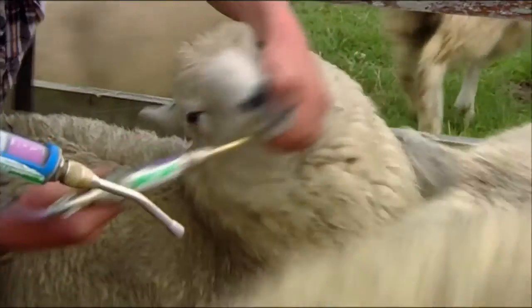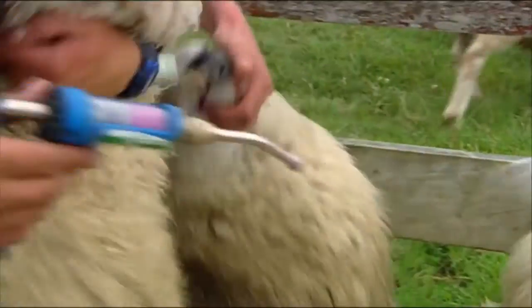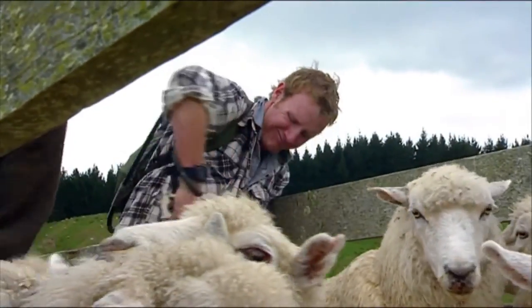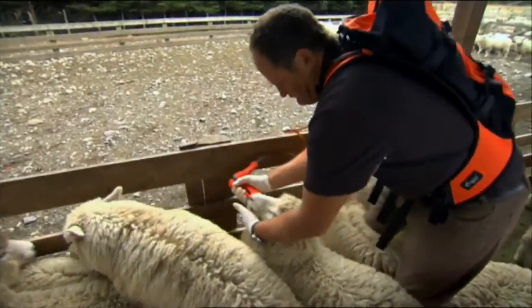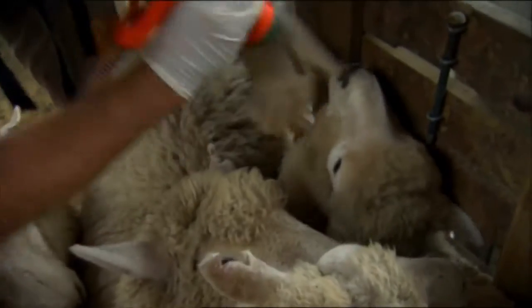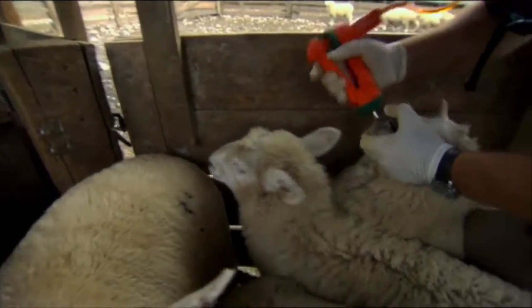And they wanted a delivery device that was innovative, and they asked us to take a look at existing sheep drenching equipment. Traditionally, when you're drenching a sheep, you come from behind the sheep and you're having to twist your arm like this. Whereas this approach, there's far less fatigue on the forearm, and it's a lot quicker, there's less back fatigue and so on. So really we just turned it around.